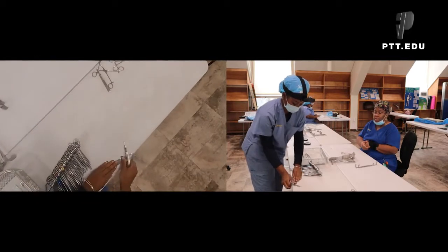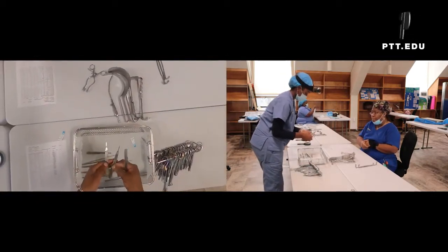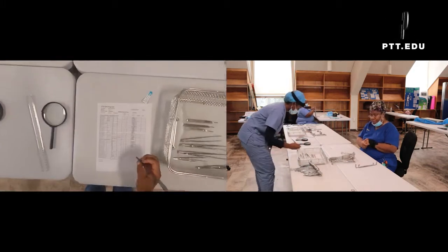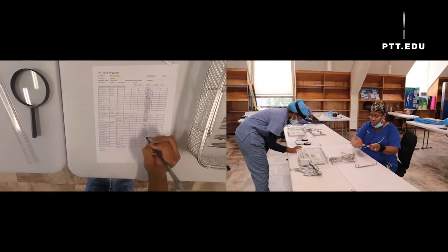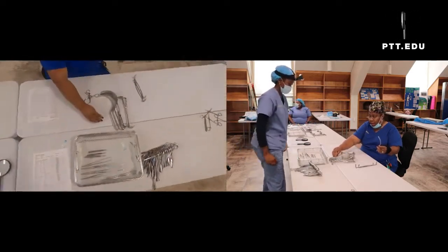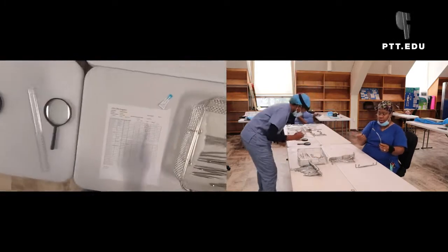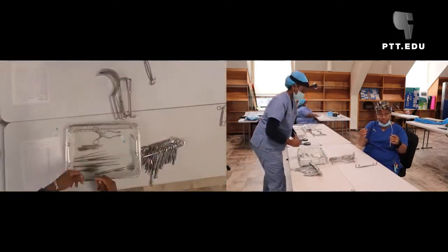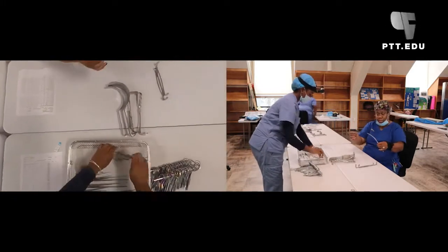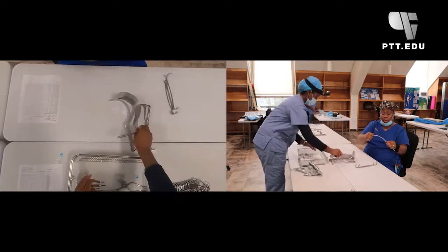So right now she is counting how many knife handles that she actually has, and that's actually on the list. And while she's doing that, I'm going to take this. This is called the Yankauer suction, and this comes in 2 pieces. You can mark this off, and I'll just put it up in here. So the whole purpose of this is when inspection is involved, which is what she's actually doing. You have to make sure this actually screws on.